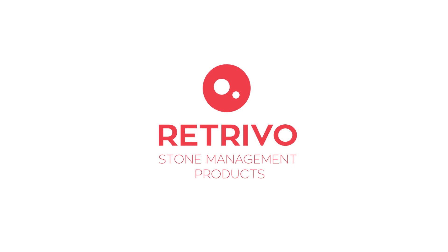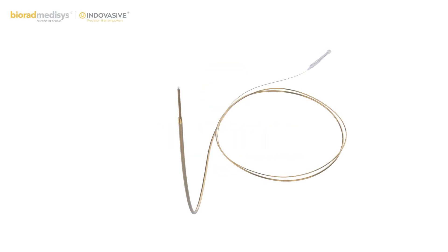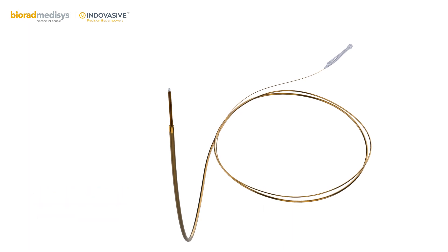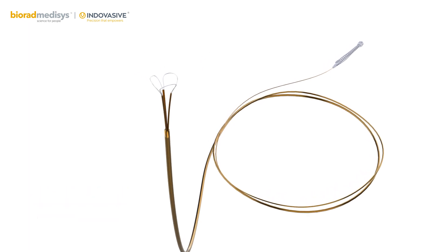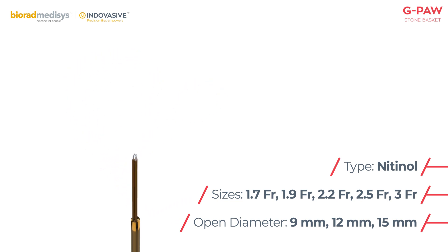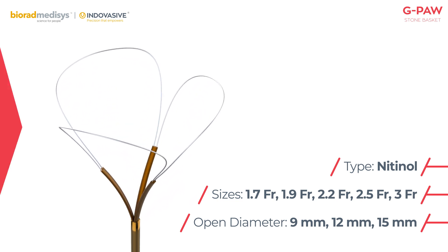Presenting Retrievo, the Stone Management Products Multi-Purpose Stone Basket, G-Paw. Uniquely designed three-arm hybrid grasper and basket in one unit, with incorporation of nitinol wire. Available in multiple sizes for diverse scope of applications.